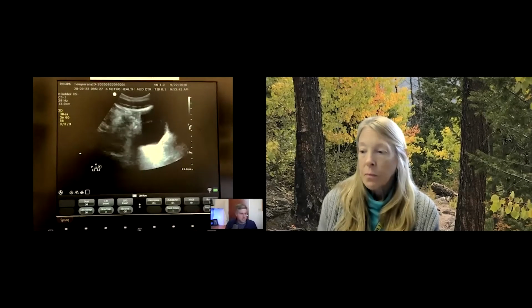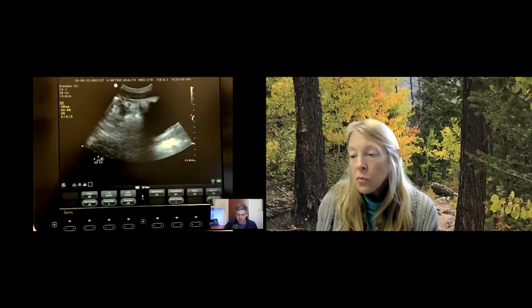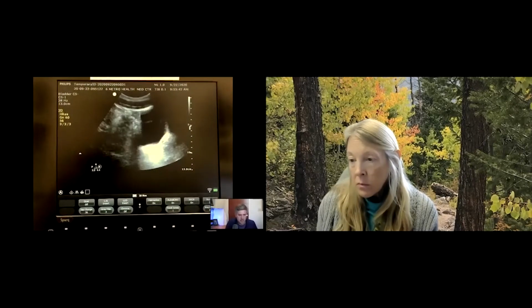And what you want to do, this is an example of a sagittally oriented bladder. And you find the bladder, right? Find your pubic symphysis, go right above it, find that bladder, and scan back and forth. And what I like to do is scan the entire pelvic bowl, right? Scan all the way to the vessels, like the iliac vessels and the iliac crest on one side, and then scan all the way to the vessels and the crest on the other side. So you see the whole width of the bladder, right?